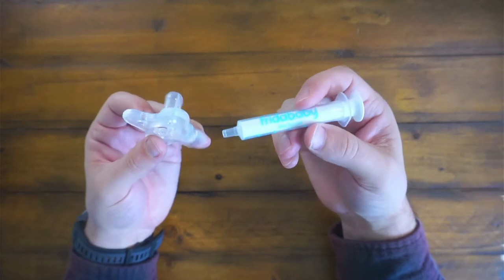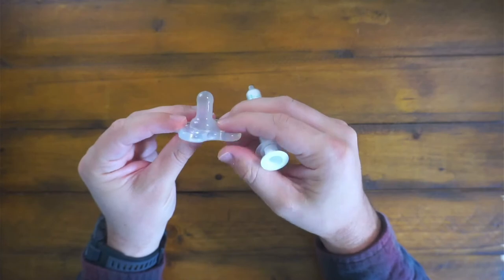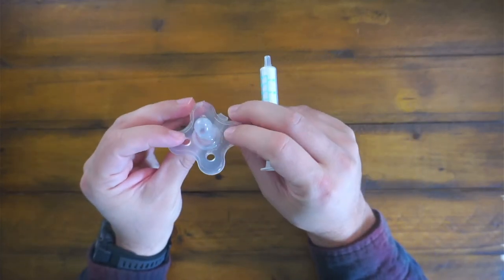And it's super easy to clean with warm, soapy water. Fill the syringe up with warm, soapy water. Plunge it through the pacifier just to clean it. It can be sterilized as well.